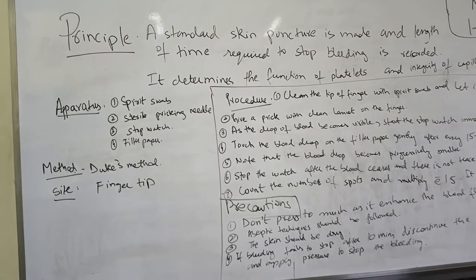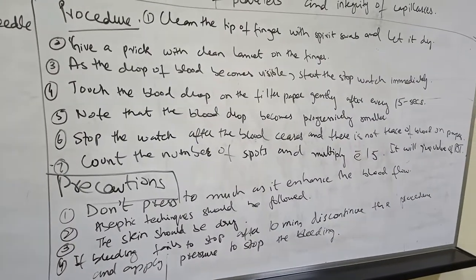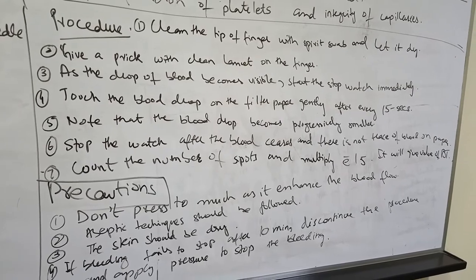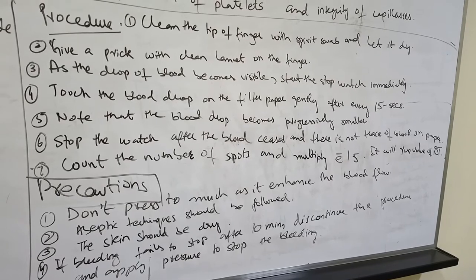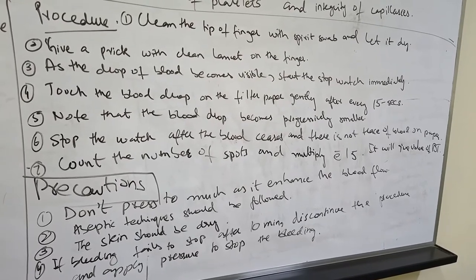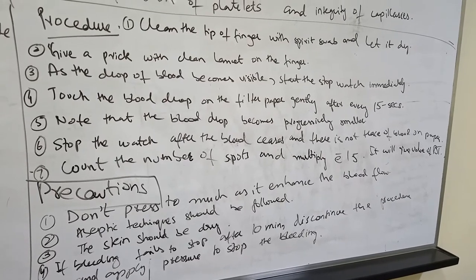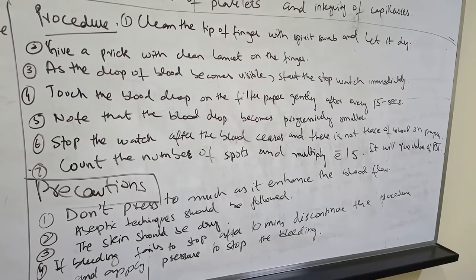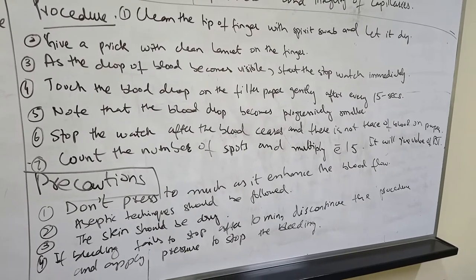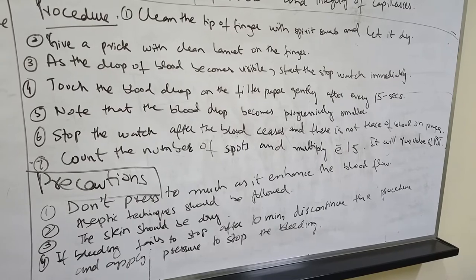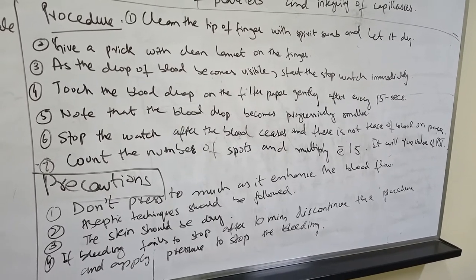Now the procedure. We usually take the tip of the finger. First we will clean the tip of the finger with the spirit swab and let it dry. Then we will give a prick with the sterile needle on the finger. As the drop of blood becomes visible, immediately start the stopwatch and touch the blood drop on the filter paper gently. Remember, do not press your finger on the filter paper — only apply blood to the filter paper.